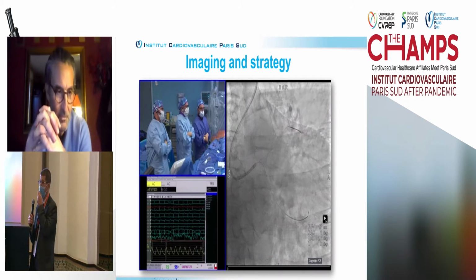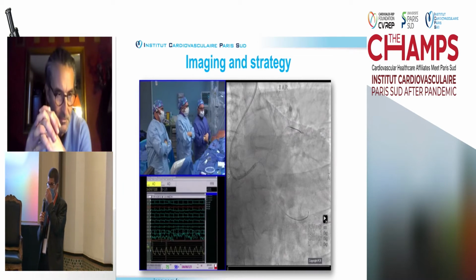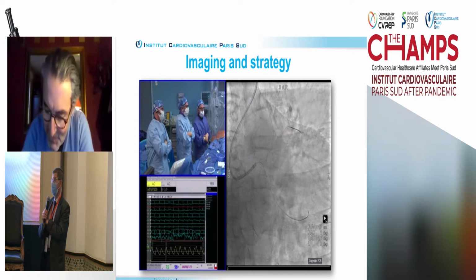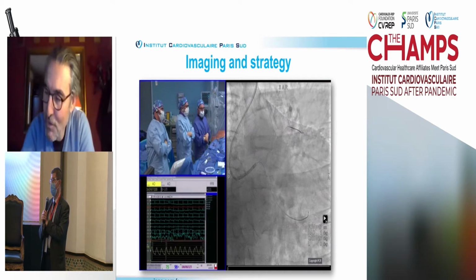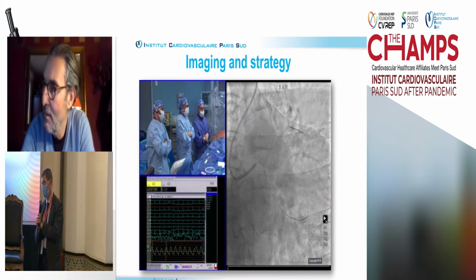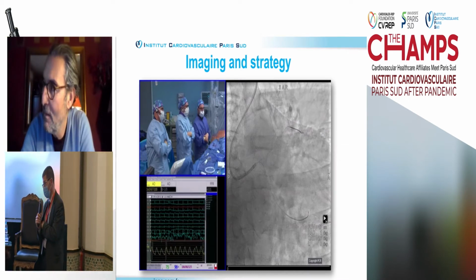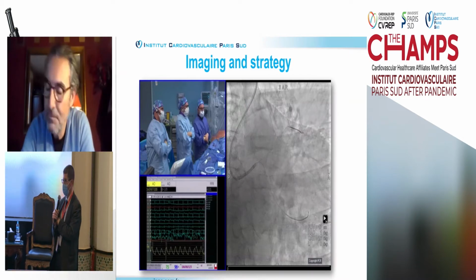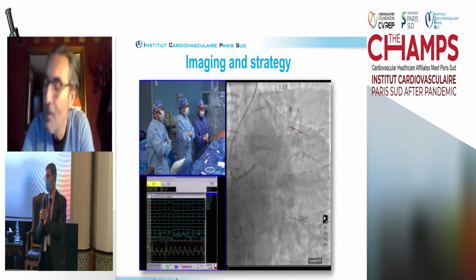So you're going to stent this diagonal after I put a stent, to see if the ostium is affected. But you know that it's simpler to fix the diagonal with stenting before. Yes, I know that. But you're going to do it after. Yes. Okay, Dr. Saeed. You can do it before and you can do it after.